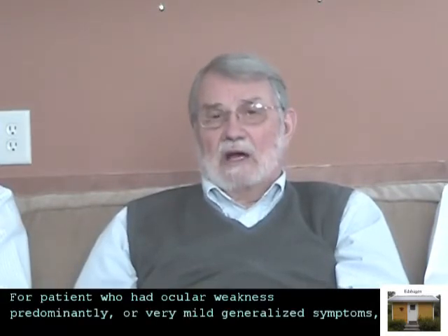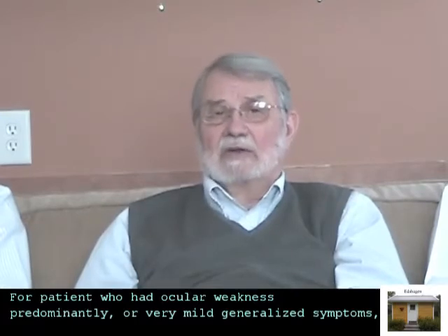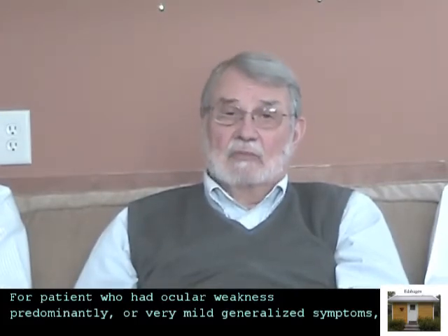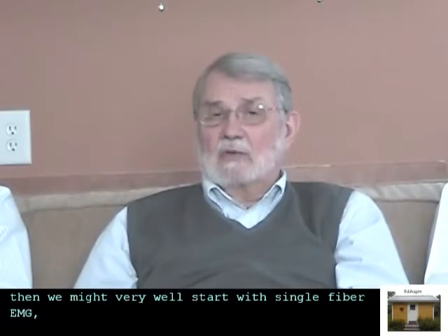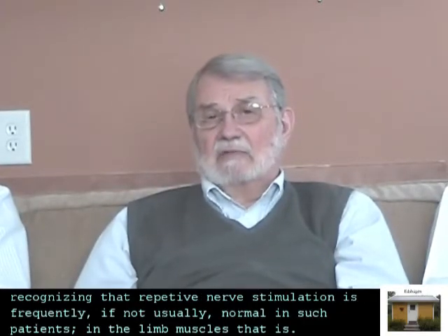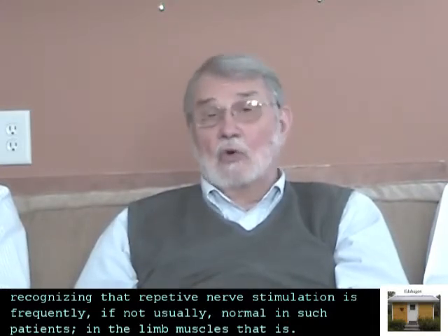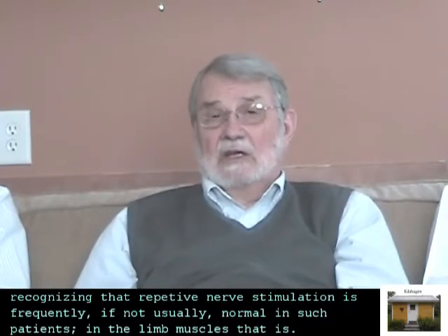For a patient who had ocular weakness predominantly, or very mild generalized symptoms, then we might very well start with single fiber EMG, recognizing that repetitive nerve stimulation is frequently, if not usually, normal in such patients, in the limb muscles, that is.